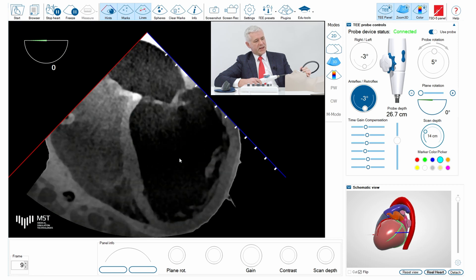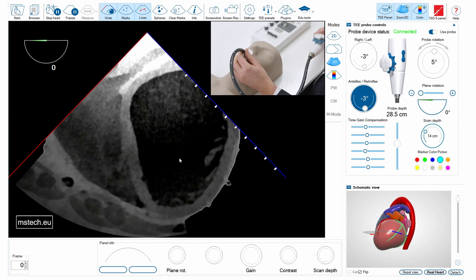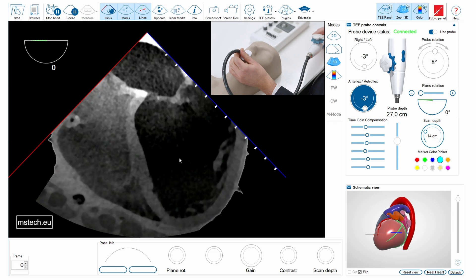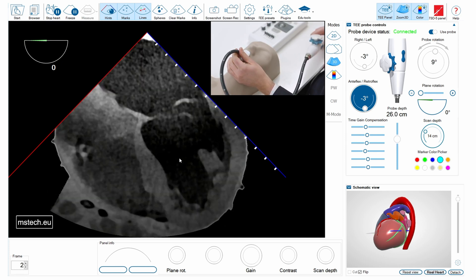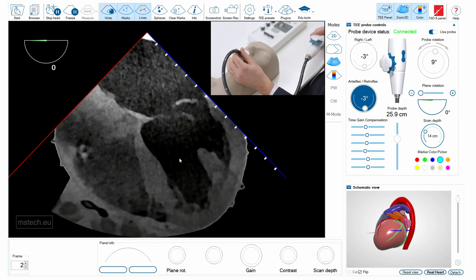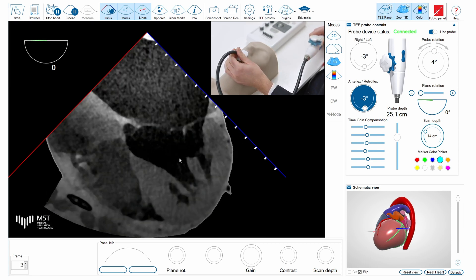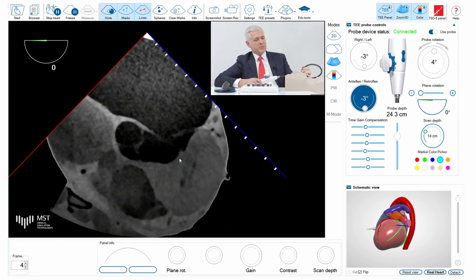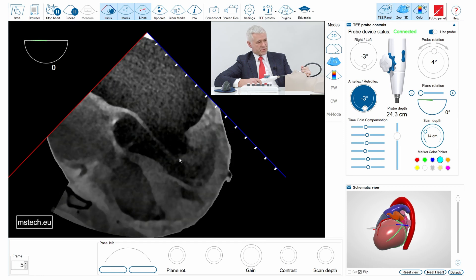I can scan from the mid-esophageal deep projection showing the posteromedial commissure, then pull back showing the center of the valve. This is a very oblique, off-axis view. Going to the five-chamber view, we can probably see P1, A1, and the anterolateral commissure.